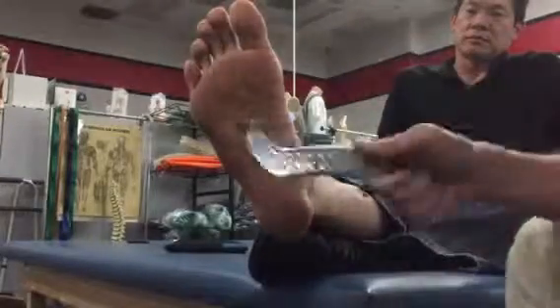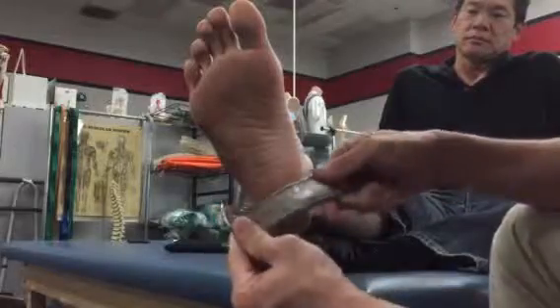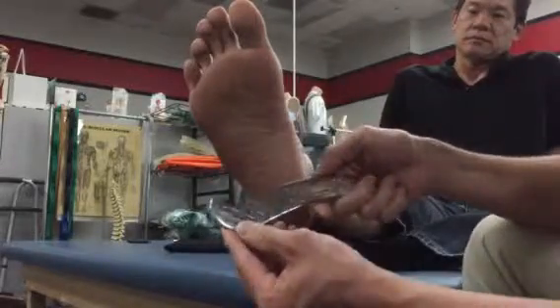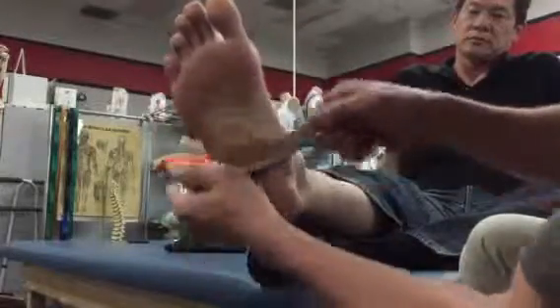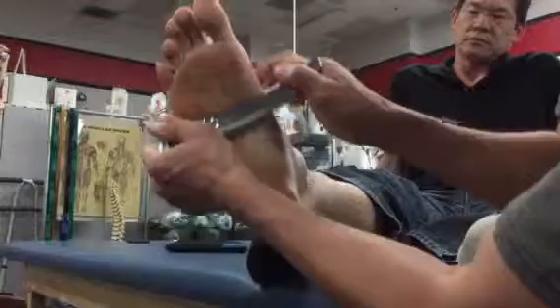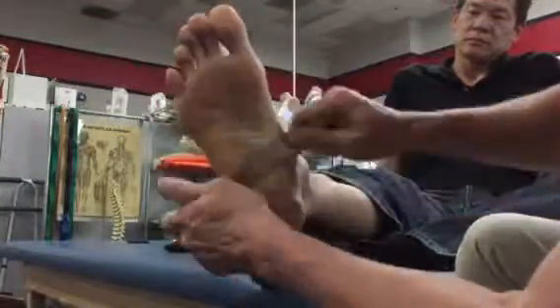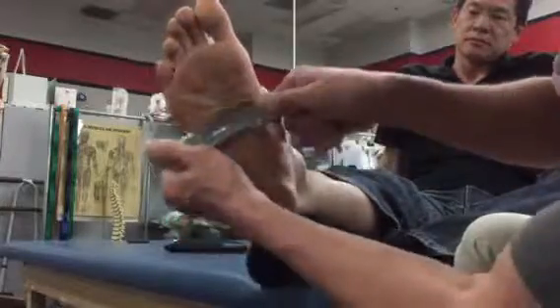I like to use almost every aspect of this ellipse tool with my patients who have foot injuries. For instance, plantar fasciitis. I'll use this and work on stroking the plantar fascia using the concave section, but then I'll also flip it around and use the convex surface.